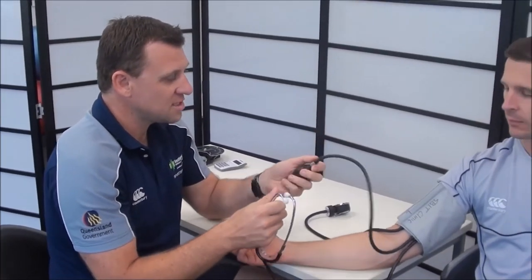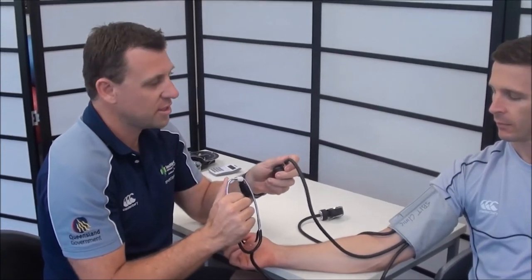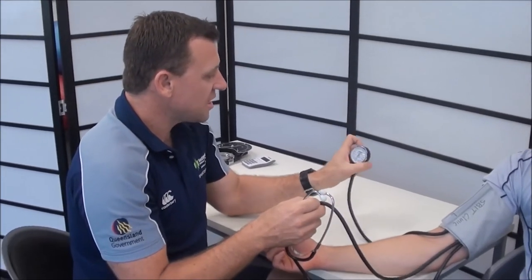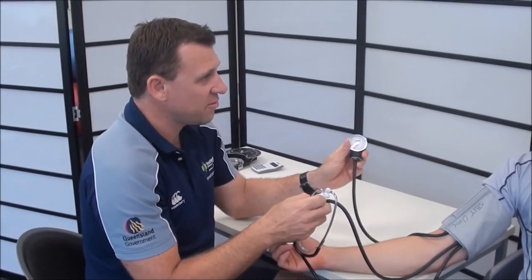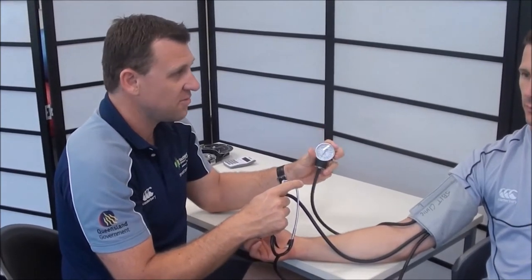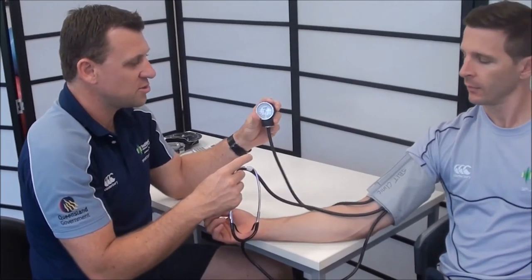If at any time the client feels uncomfortable, they can just let me know and we release the pressure quickly. The speed at which we reduce the pressure is about 2 millimetres of mercury per second — that's one of the smaller lines on the gauge. This isn't a very fast drop in pressure; we want to make sure we're hearing what we should be.